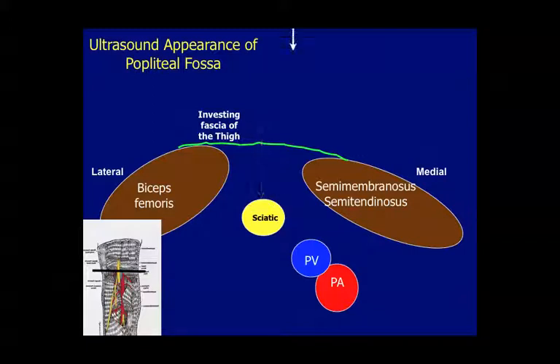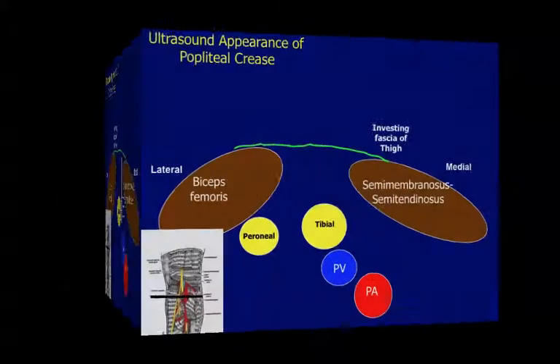By contrast, the fenestrated needle allows us to advance the needle a good bit medial to the nerve and have local anesthetic leave the needle in tissue planes that lie in a coronal plane relative to the nerve, but this distribution of local anesthetic surrounds the sciatic nerve, resulting in a successful block without having the needle tip in close proximity to the nerve.